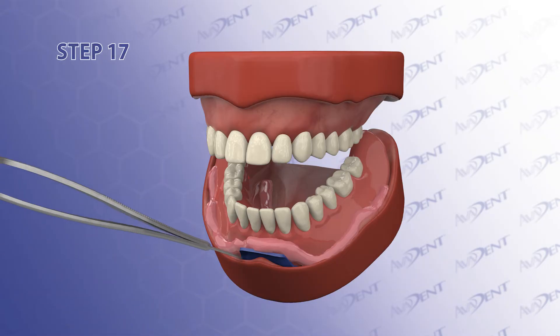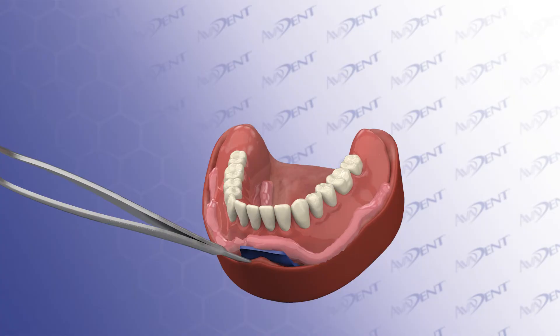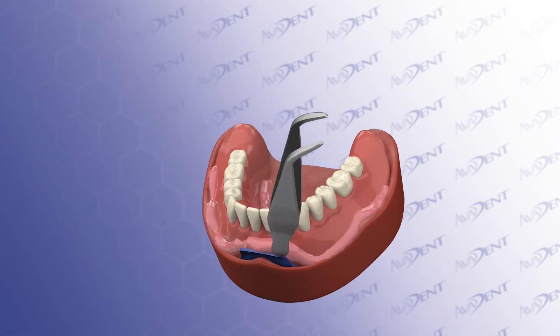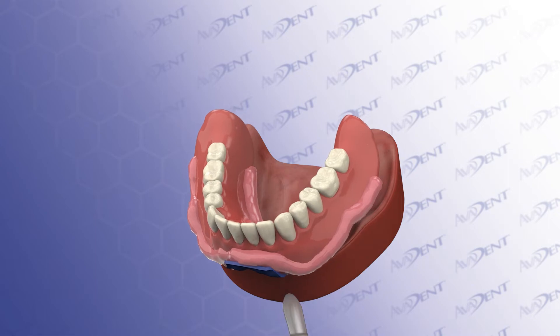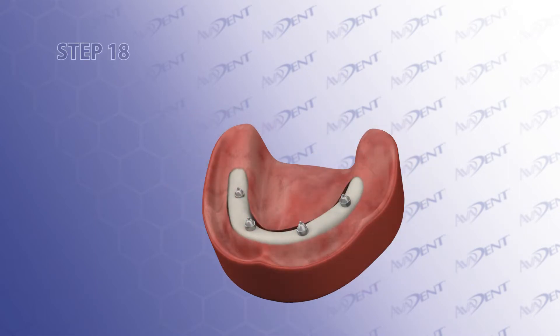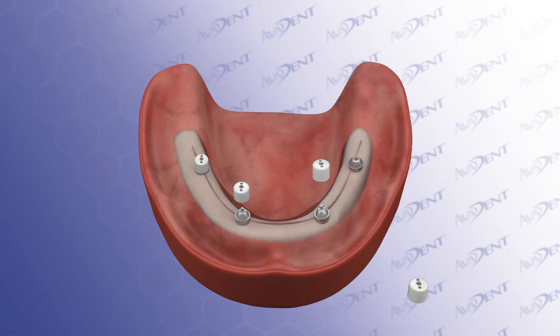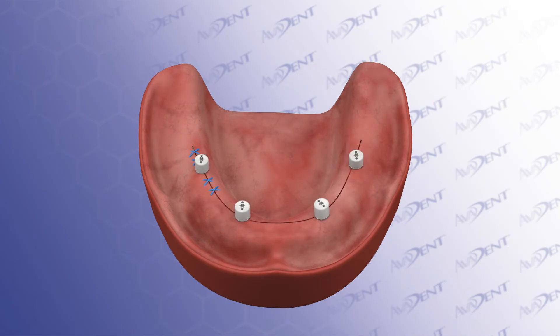Step 17. Using the back end of a cotton forceps or a periosteal elevator, pry the denture free from the multi-unit abutments. It may be necessary to loosen from the multi-unit abutments at various points around the denture. Step 18. Push down on the pressoncaps to the threaded fragment of the separable fastener that remained in the multi-unit abutments. Suture the surgical flaps to the pressoncaps. The cap will keep the tissue off the multi-unit abutments while the lab work is being completed.